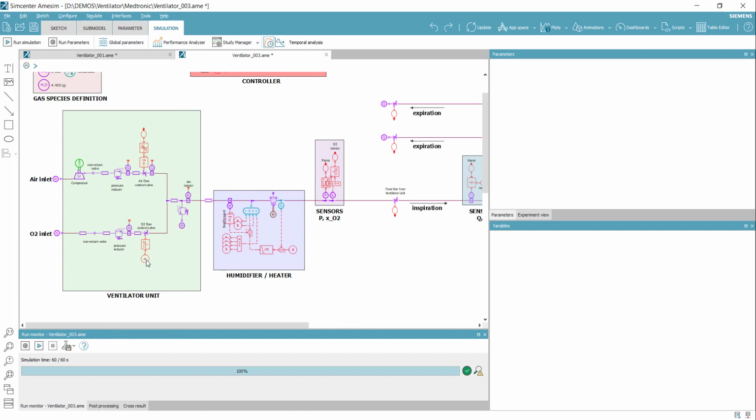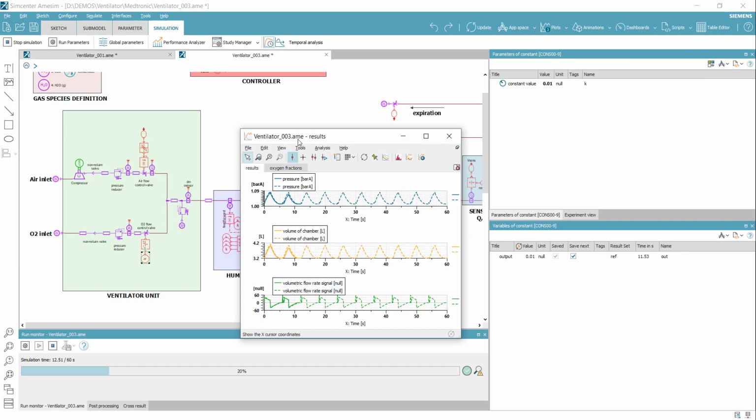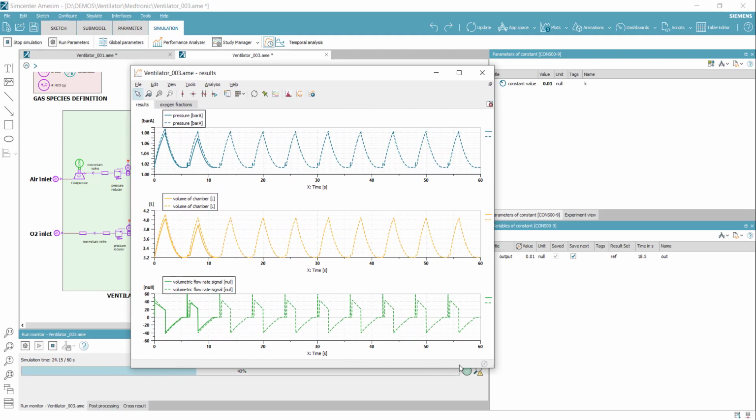What we can then do is go to the oxygen flow control valve, which has been turned off so far, as it's just air that's entering the patients. We can turn it on for a fraction and see what the impact on the oxygen concentration of both patients are. So we're rerunning the simulation, reloading the results, the configuration of the results plot that I've saved.